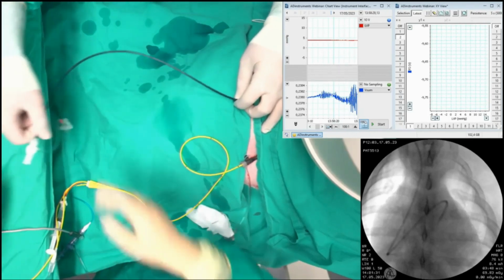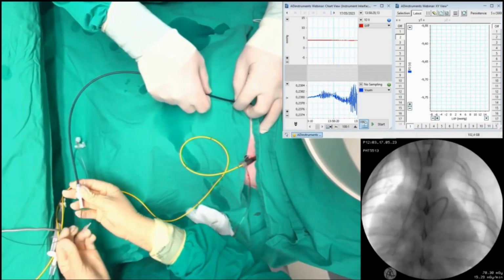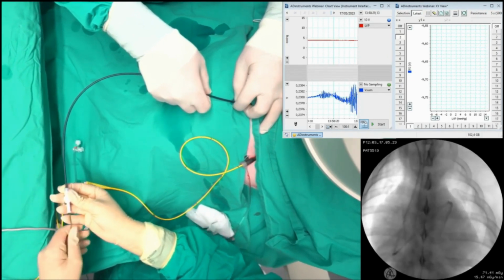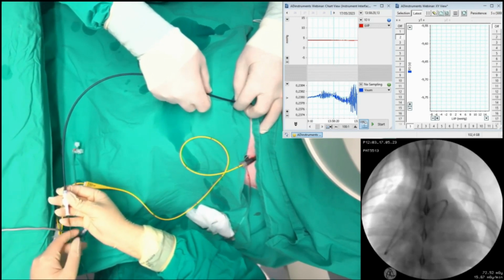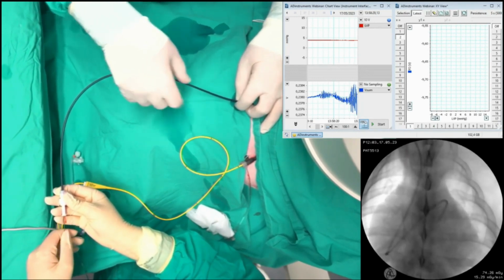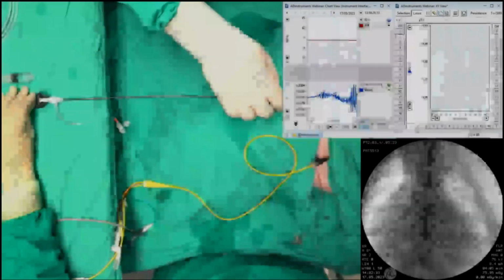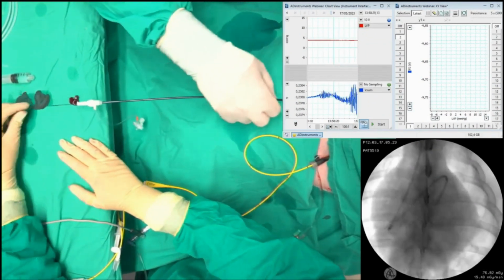So for the carotid, because there is a much straighter path between the introducer sheath and the ventricle, we don't need to use an angiographic catheter to help us guide the guide wire into the LV. So we just push the guide wire directly through the sheath. As you can see here, it's a shorter sheath than the one we just used. And after a few tries, the guide wire goes inside the left ventricle. And once it's there, you can advance the sheath over it.